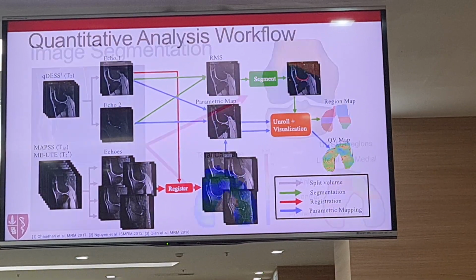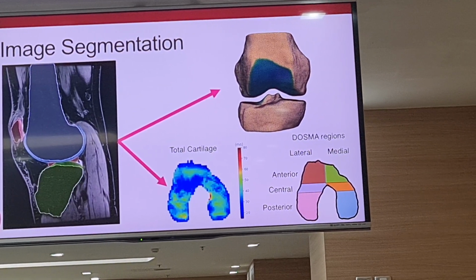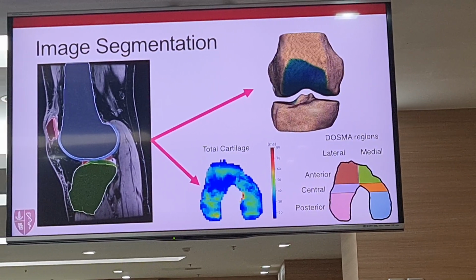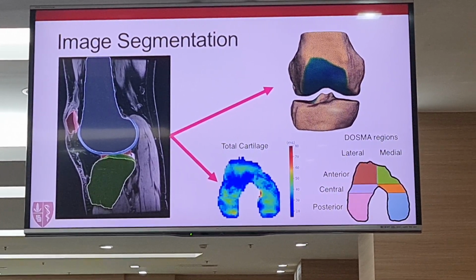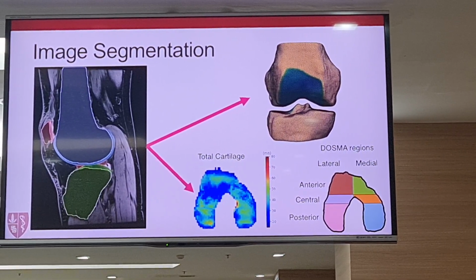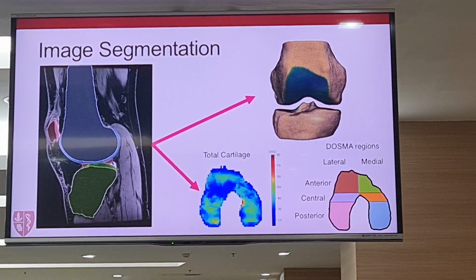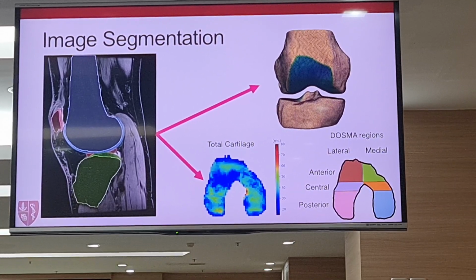And so this is where DL is becoming really useful, and I think we're not quite at a solved problem, but I think we're at a really good stage where the automated methods are getting very close to the manual segmentation. And I think in particular, the big breakthrough that's being done here is that we're now starting to look at our outcome measures as our loss functions, instead of a structural similarity or something of that sort.